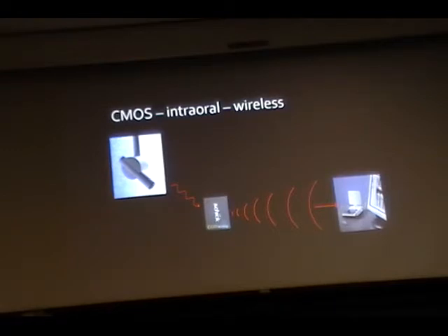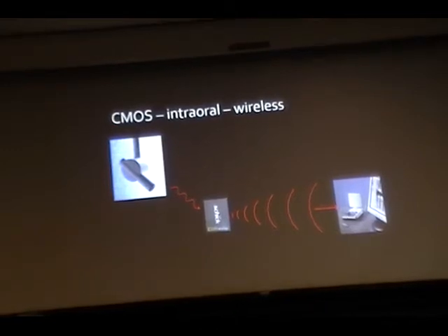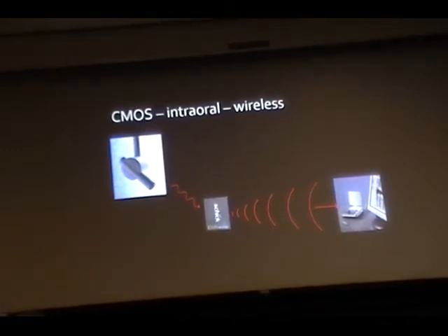As a dentist, why should we be concerned? Again, whatever you're saying is right, but I'm looking for something else. Well, ultimately, you could affect the image quality, I guess. So basically, because you're going to use wireless, that means you need to load up with more chips, more electronics, so it becomes much bulkier.